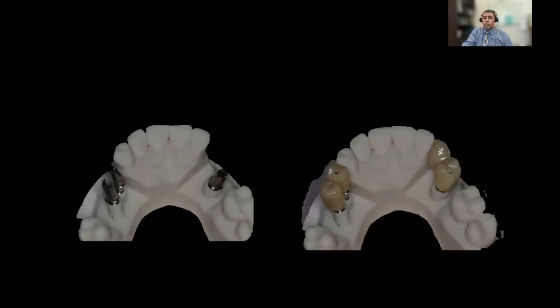Here's another patient where we utilized single implants with a mesial cantilever to replace anterior teeth, and again stopped at the second premolar. He still has some posterior teeth, but we did not feel the need of including a distal cantilever in this case, which would put more torque forces on these implants, particularly with the size of these implants being around 4.2 millimeters.